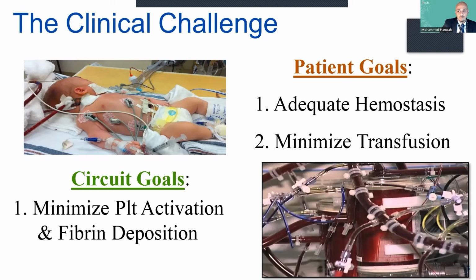One of the predominant challenges that face us as clinicians at the bedside when we take care of ECMO patients is that clinical challenge of facilitating appropriate clot formation while avoiding thrombotic complications. So you want to have the patient be able to maintain hemostasis, prevent bleeding, minimize transfusion.